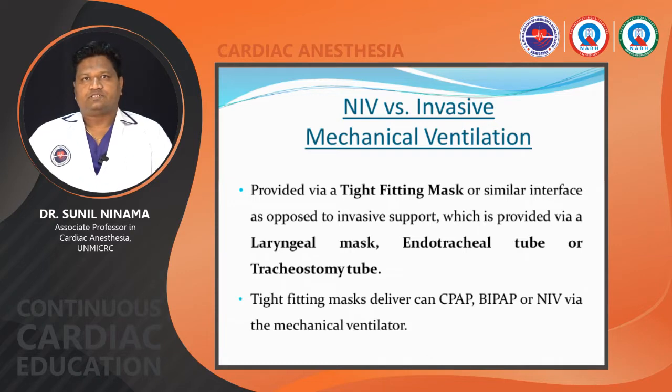What do you mean by non-invasive versus invasive mechanical ventilation? Non-invasive mechanical ventilation is provided by a tight-fitting face mask. Invasive mechanical ventilation is provided by a laryngeal mask, endotracheal tube, or tracheostomy tube. By a tight-fitting face mask, you can deliver BiPAP as well as CPAP.